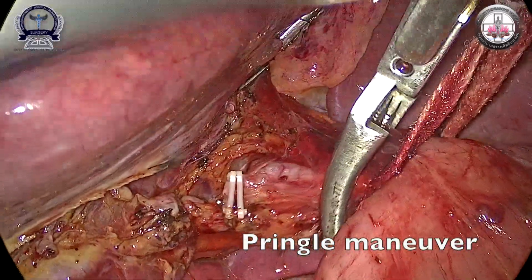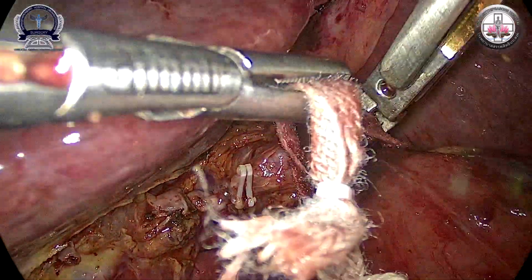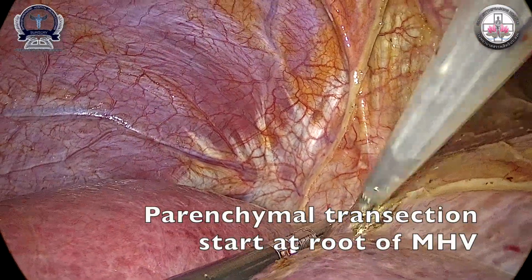The Pringle maneuver was performed by the intermittent technique. Parenchymal transection was started at the root of the middle hepatic vein.